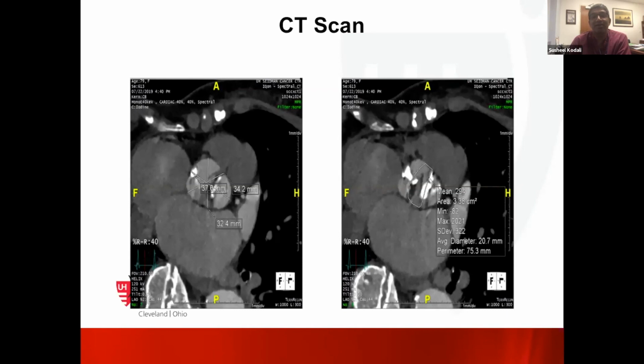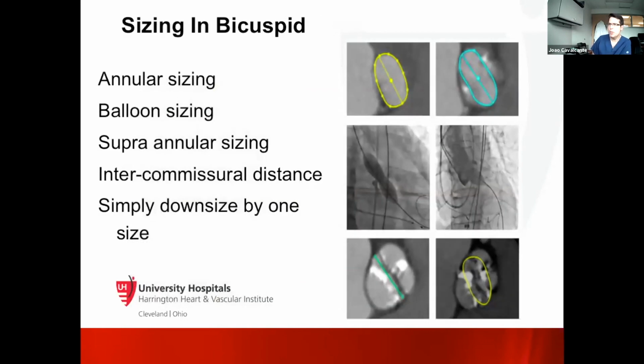So there are things that are hard to predict, with the different valve types and sizing, but I agree also. I focus on the annulus. If I may just make a quick point too, looking at the post-implant CTs also will teach us a lot, right? How much of that raphe that is so calcified will give in will probably preempt you to do something such as a laceration or something like that, that also could facilitate that deployment.